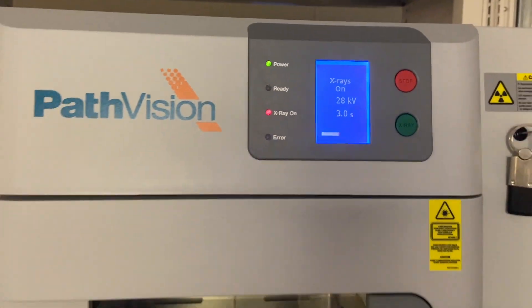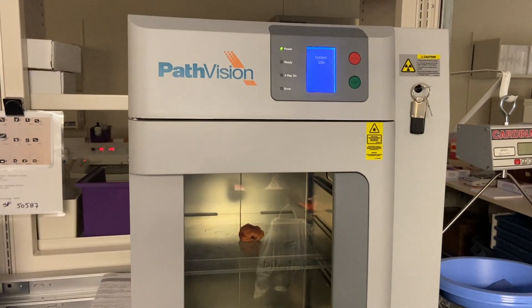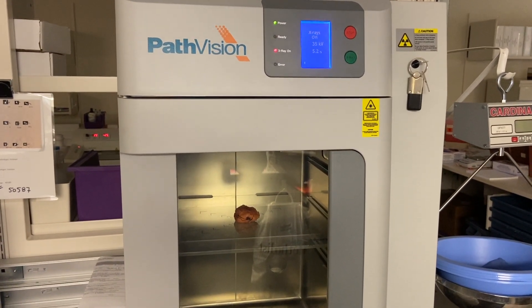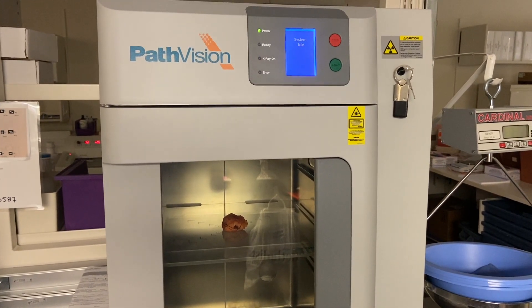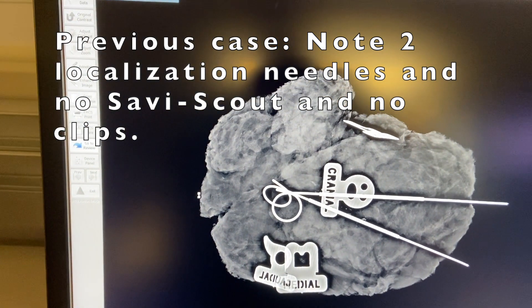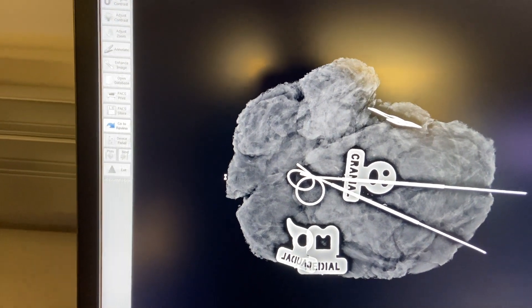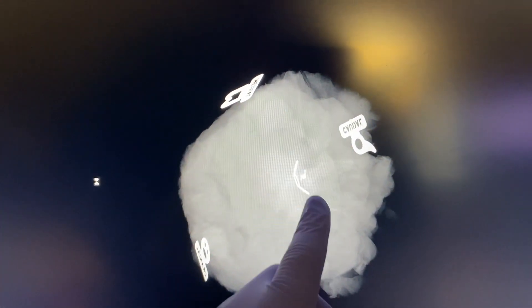It'll do its business — I've already entered all the patient demographics in the computer. It takes a couple of minutes; this is its last exposure. Then it starts to process — you'll see a little thinking hourglass — and there's our specimen.